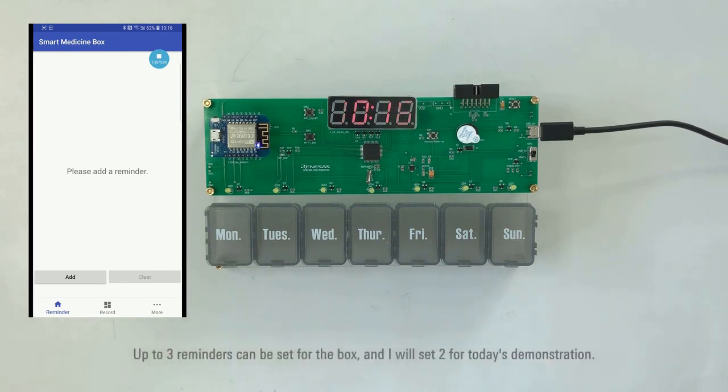Up to three reminders can be set for the box.